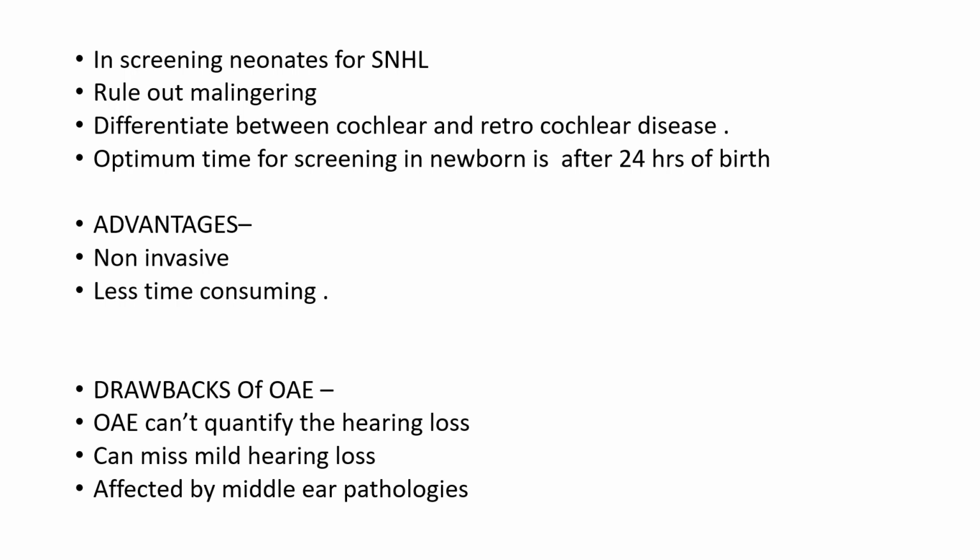Okay, so what are its advantages? It is very less time consuming, almost 2 to 3 minutes to test both ears, and it is a non-invasive procedure. Okay, so what are the few drawbacks of otoacoustic emission?